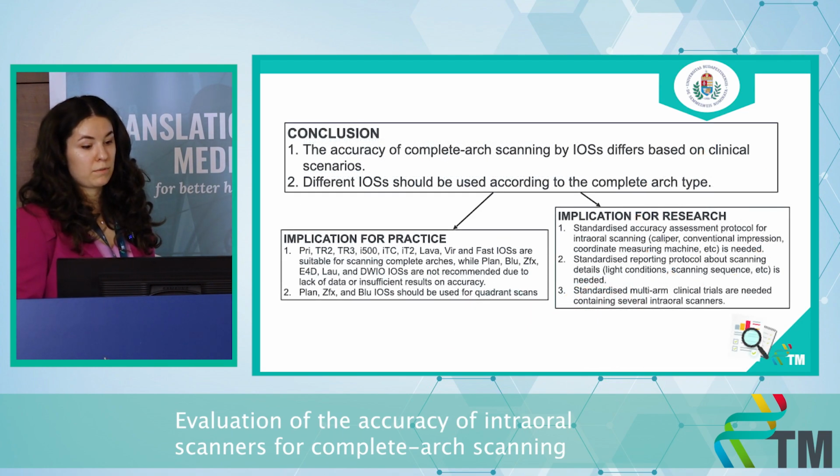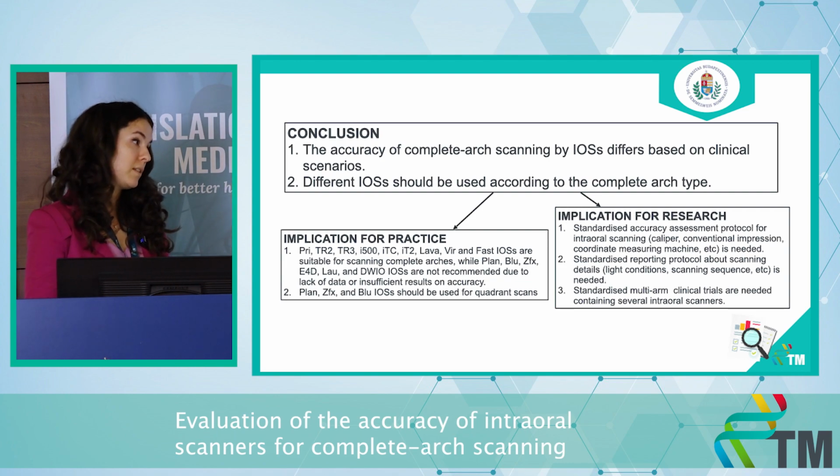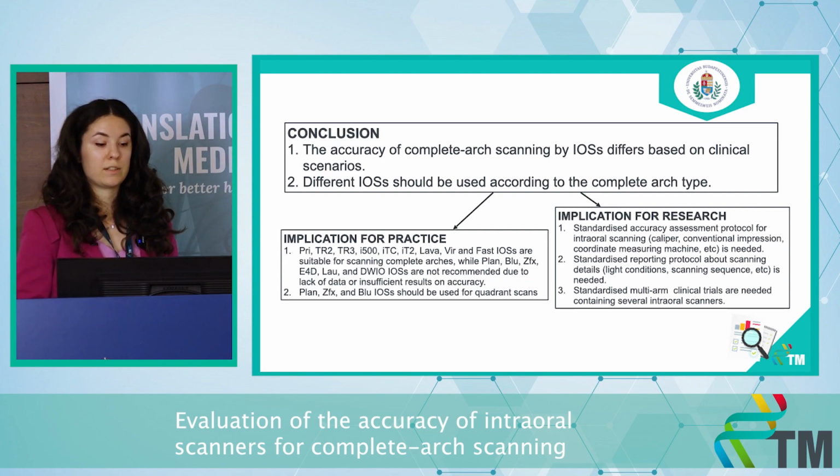Our conclusions were that the accuracy of complete arch scanning with the IOS differs based on the different clinical scenarios, and that different IOS should be used according to the complete arch types.